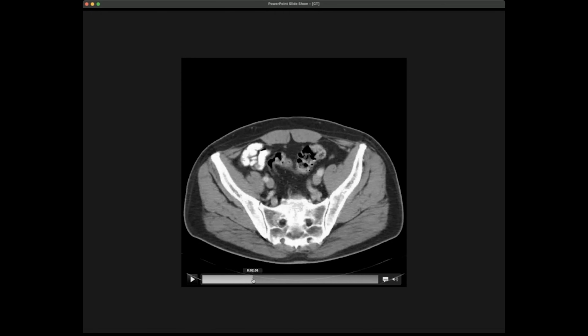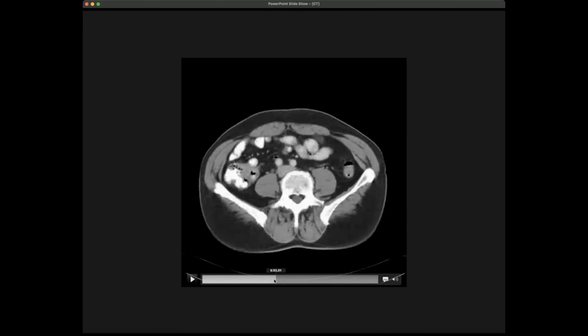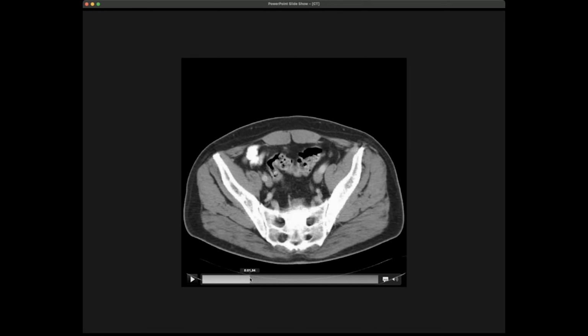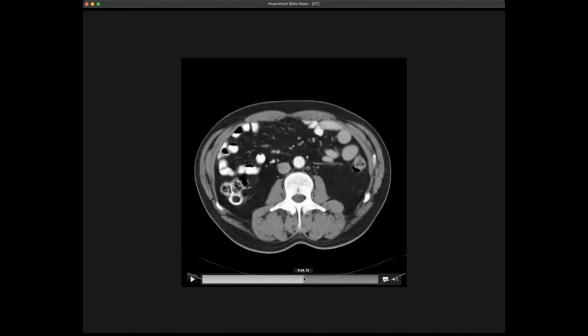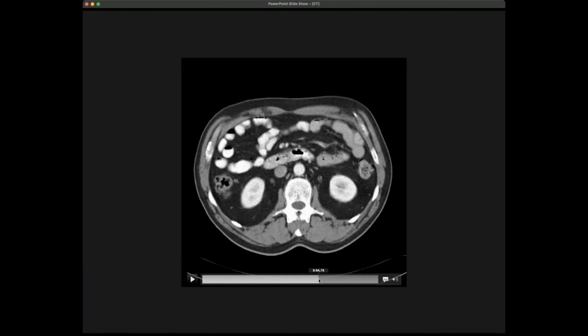And so then you can scan further through, so you start to see some other things. Now, one thing that you see here is that we know it was black for the air, but here you start to see something which is bright also. So you see here some bright structures which seem to be within the belly. And when you go through it, it doesn't look like this can be a bone. So what happens is that here you start to use contrast agents, and we come back to that later on.